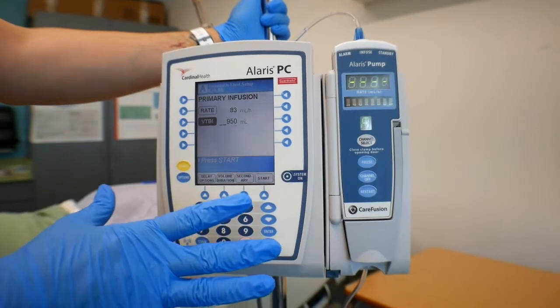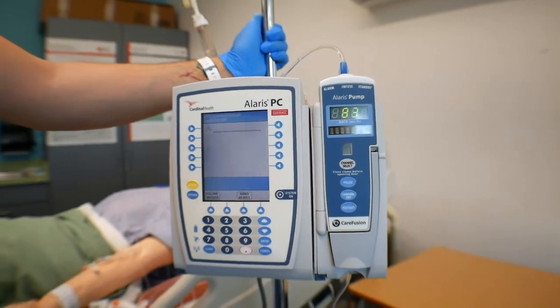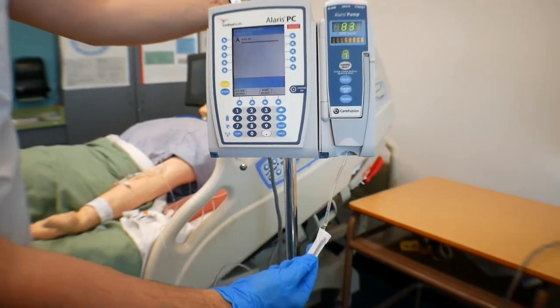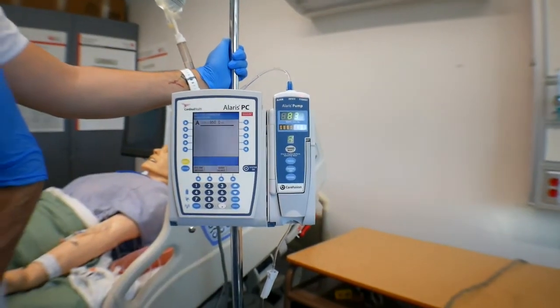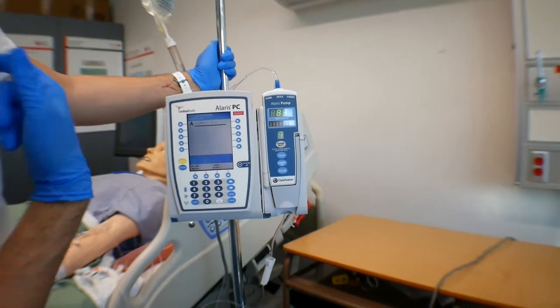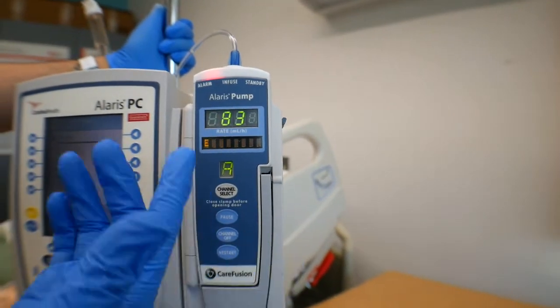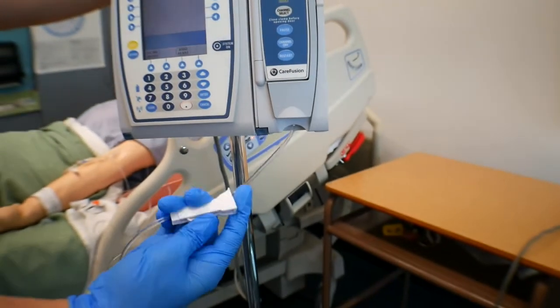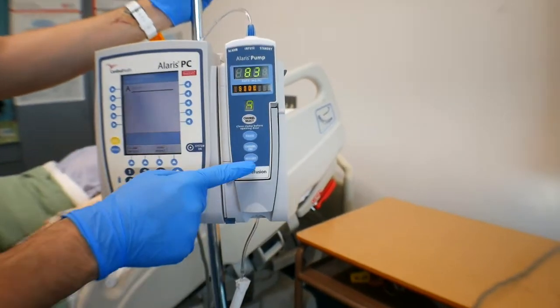And then if you already verified that, you're just gonna go hit start. It's right here. And make sure that your clamp is unclamped, because if it's not, it's going to beep. I'll show you how it sounds when it beeps. Right there. So it's saying that it's occluded, patient side. So for that, if you hear that beeping, you always check the line if it's clamped, if the patient is actually occluding the IV site, and if it's not, just go ahead and press restart.